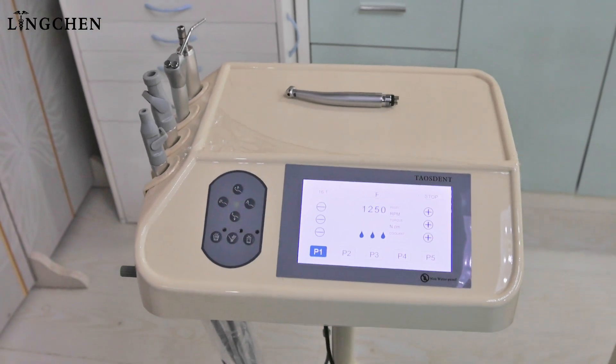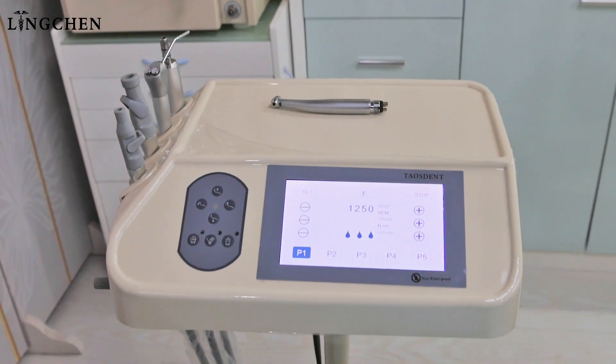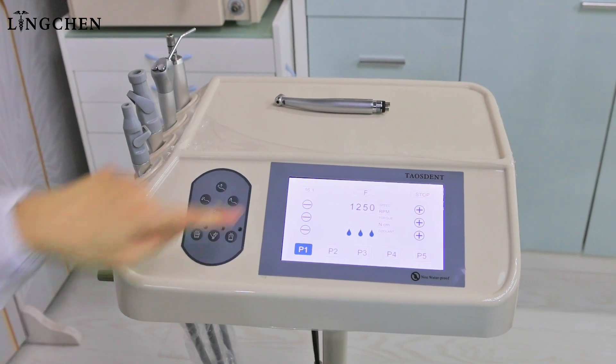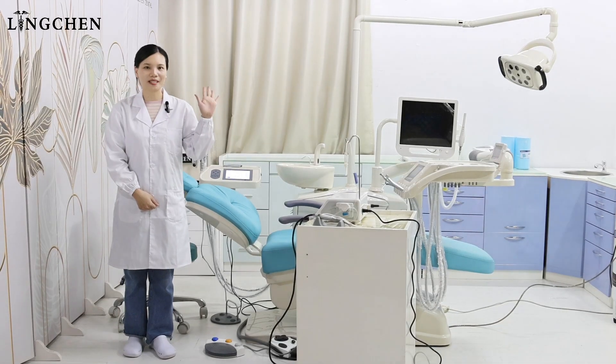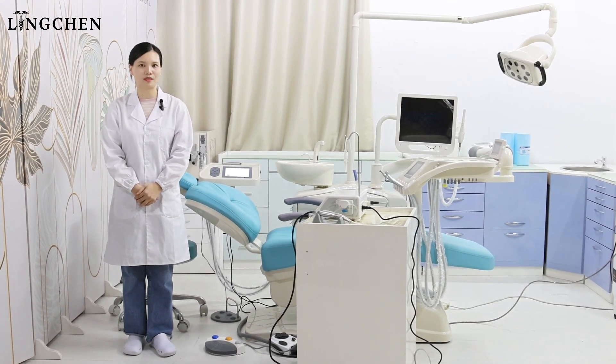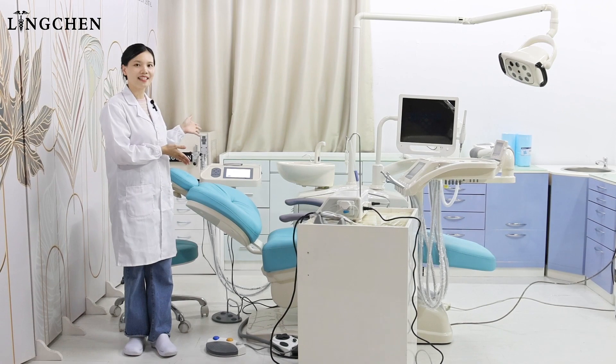It is so near to the patient and to the assistant and dentist. It's easier for the dentist to adjust the screen. Hello, nice day to you. Today, we will share with you good news about the built-in implant dental chair.